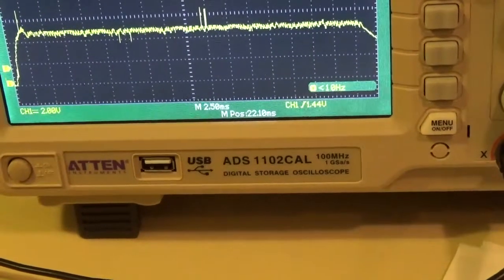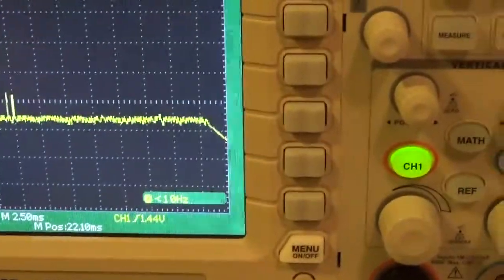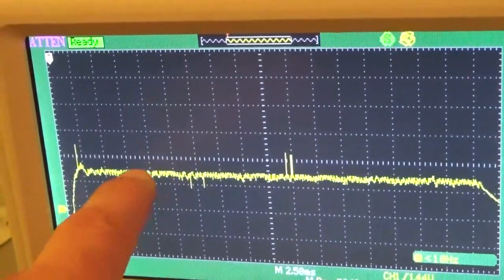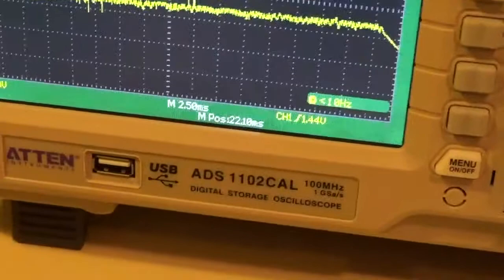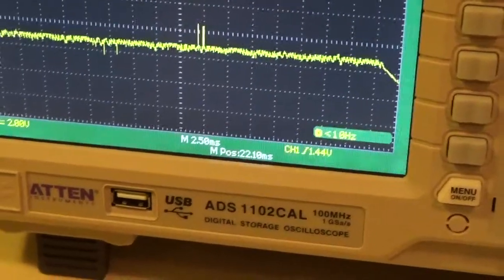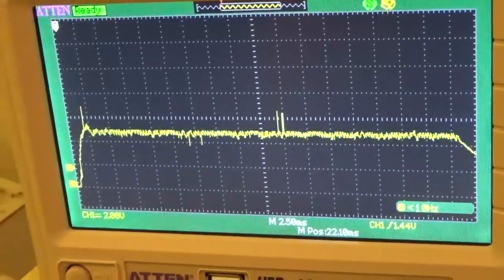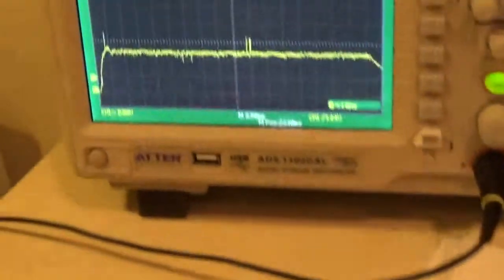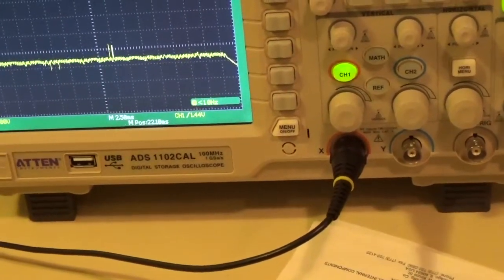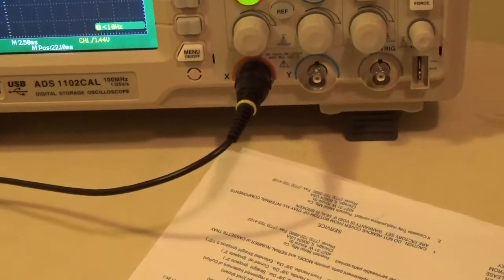I would say this is shooting 12, roughly. We had 10 set. So you've got 2 volts, 4 volts, and about 2 more clicks, which is 0.4 volts per dot. So it's about 2.4 volts vertical is what we're reading. And if 1 volt equals 100 mA, 2.4 volts equals 240 mA. You see how that works?